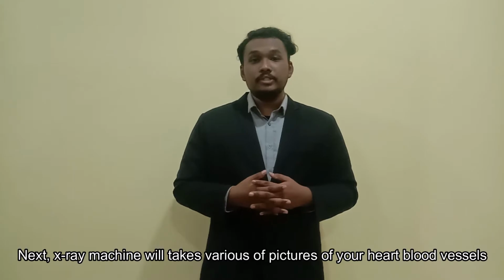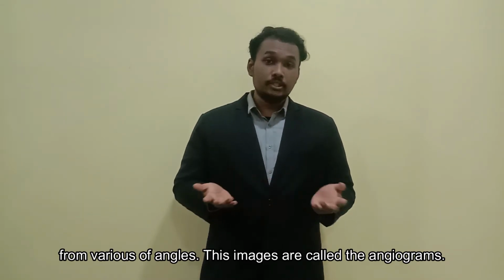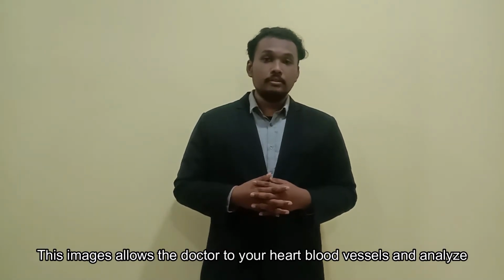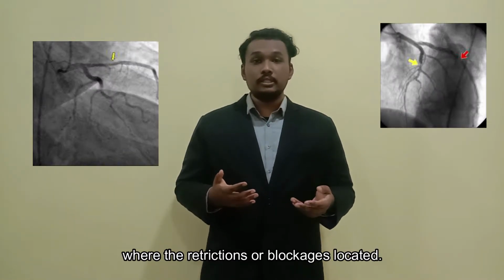Next, the X-ray machine will take various pictures of your heart from various angles. These images are called angiograms. These images allow the doctor to see your heart blood vessels and analyze where the restriction or blockages are located.